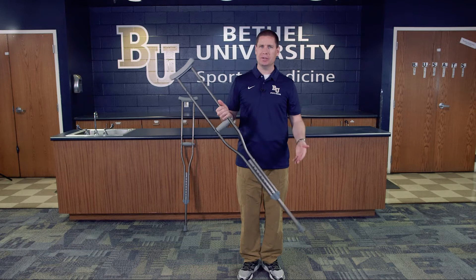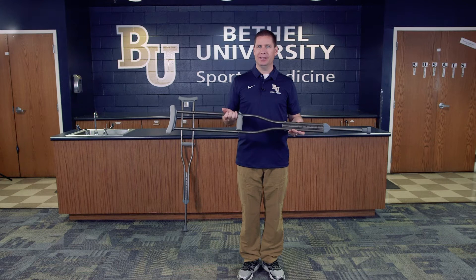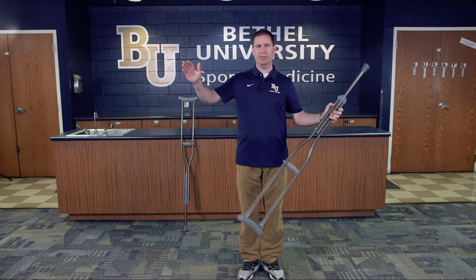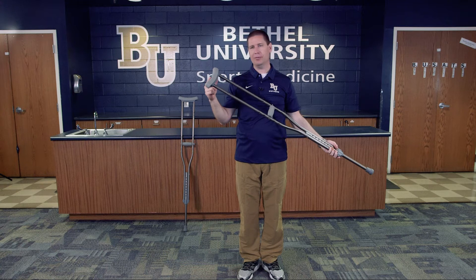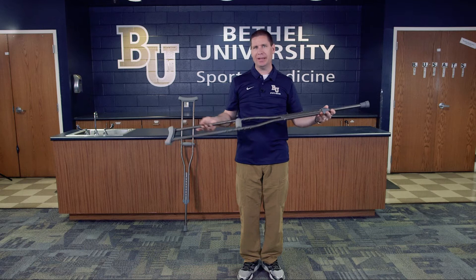One easy way to get an accurate measurement is to have the individual take one arm and bend it at 90 degrees, and take their other arm straight out. The distance from the elbow to the fingertips is the distance you would want from one end of the crutch to the other. If there are no number readings on the crutch, that's a very easy way to do it.